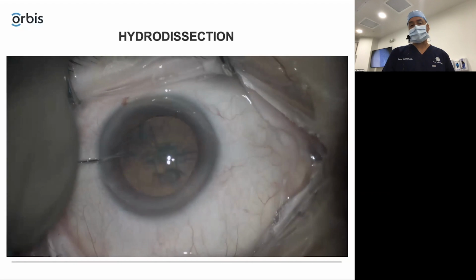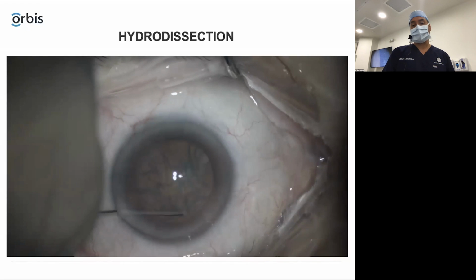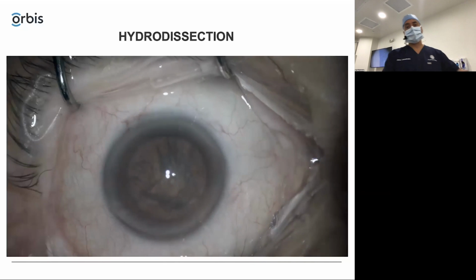So I'm going to kind of dig my cannula in and rotate it. That's very critical. If you can rotate a nucleus, you're not going to have a hard time with the case. You're going to be able to crack it and get those quadrants out.